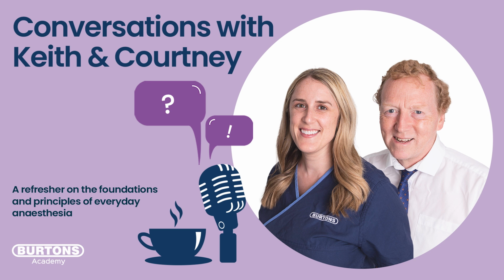Yeah, their ears are quite fluffy, aren't they? I wonder if there might be quite a lot of hair there, but they're big. I mean, they're certainly big enough to get a reflectance probe down there.